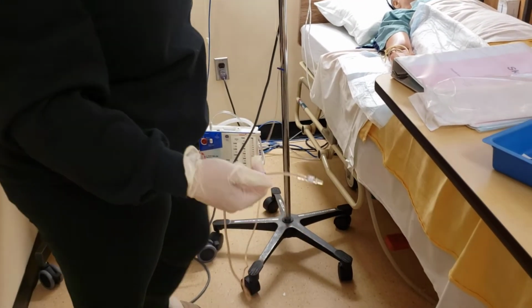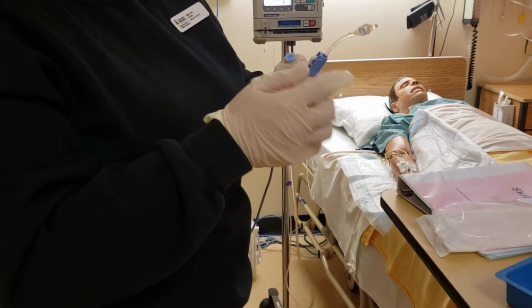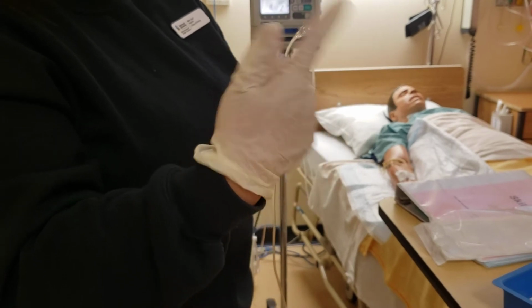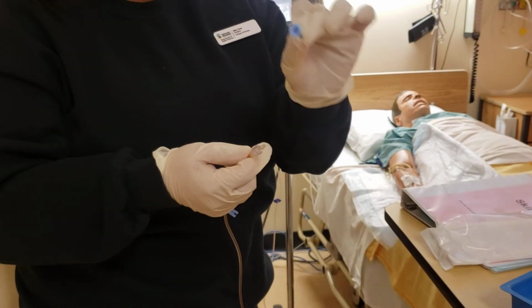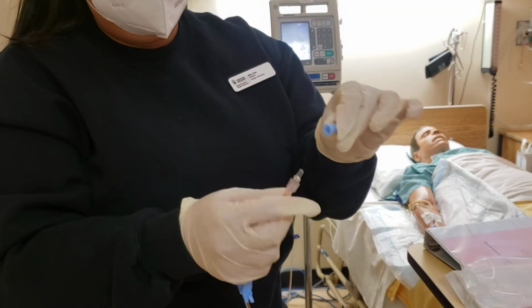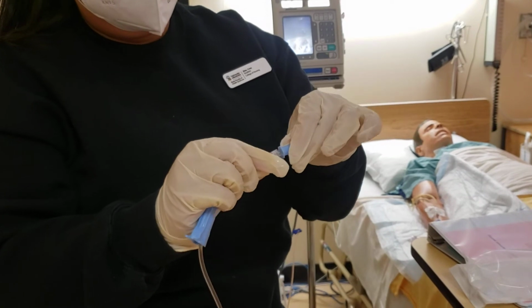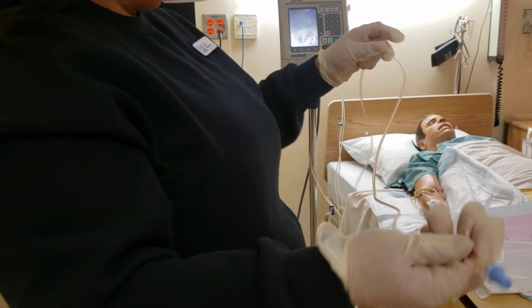Once the blood has reached almost the end of the tubing, we'll clamp or cover the end of our tubing. We also want to make sure that this remains sterile, so make sure it doesn't touch anything, or else we might introduce infections.